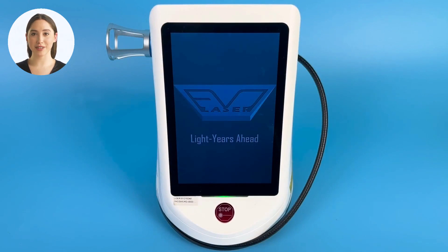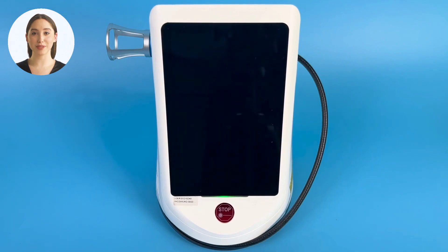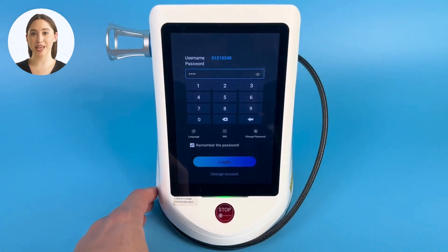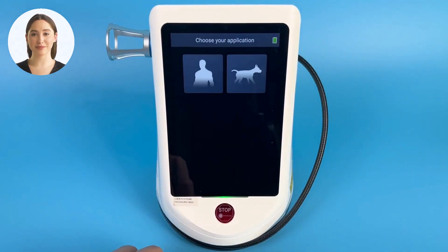To turn the laser on, hit the power button on the rear of the laser console. The EVO will go through a few boot-up screens. Once the system turns on, you will be prompted with the login screen. The preset password is 0000.